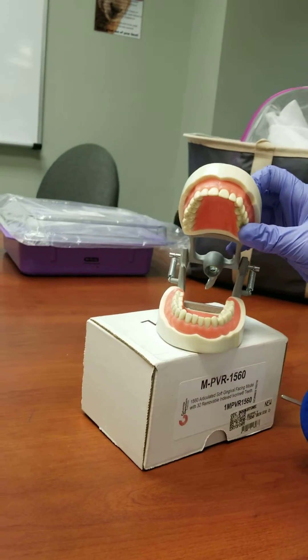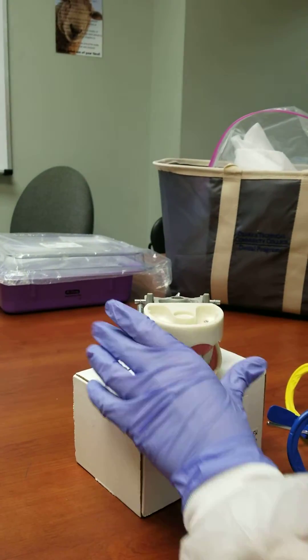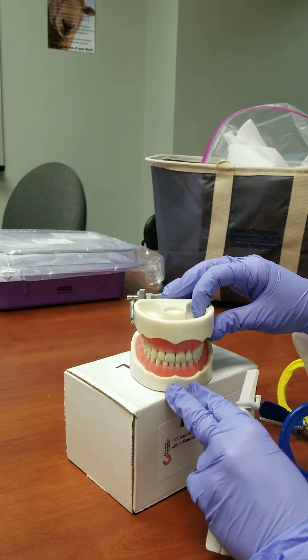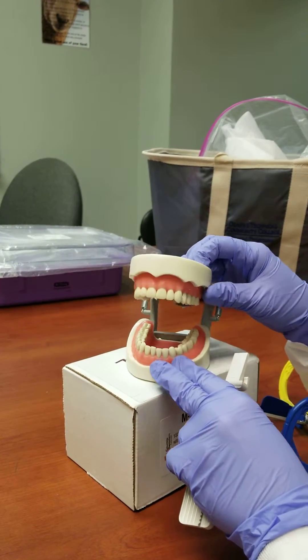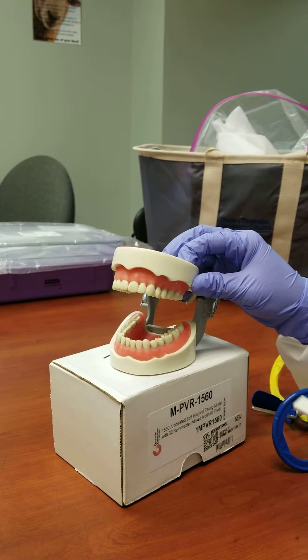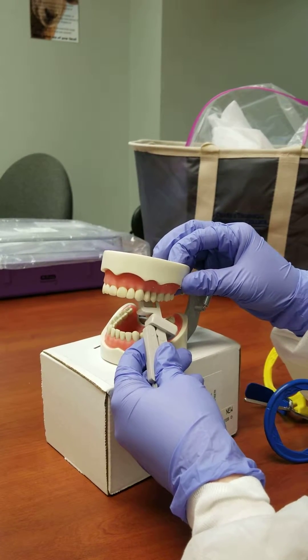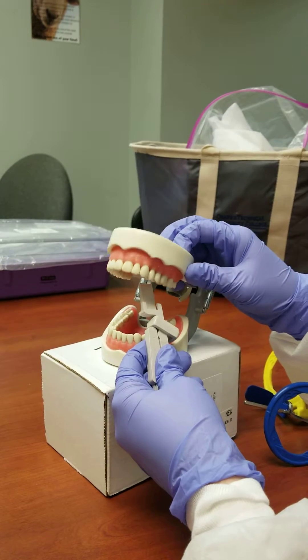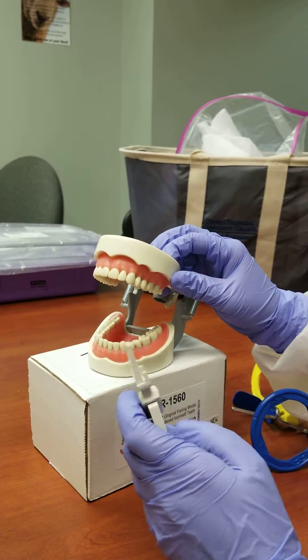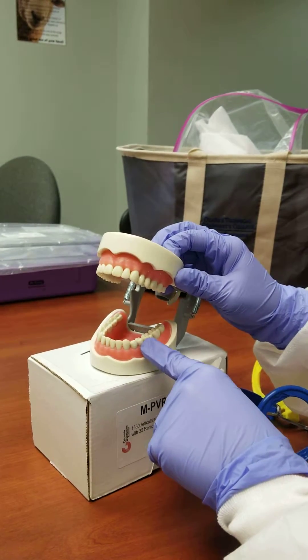Then I'm going to go to the bisecting technique — the PA of number 13, which is the left maxillary second premolar, right here. Then I'm going to do number 20, which is the left mandibular second premolar.